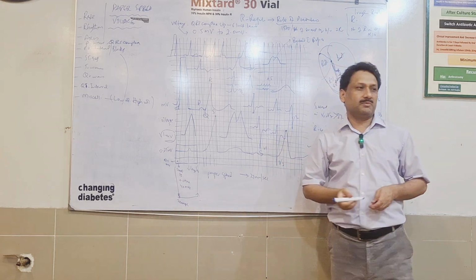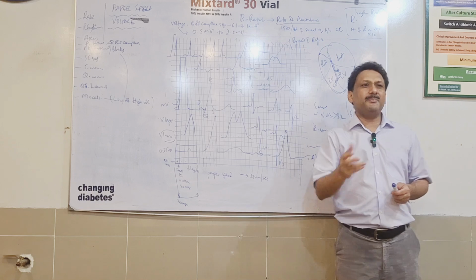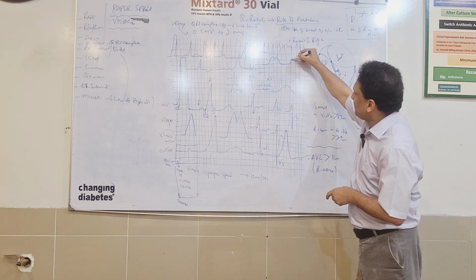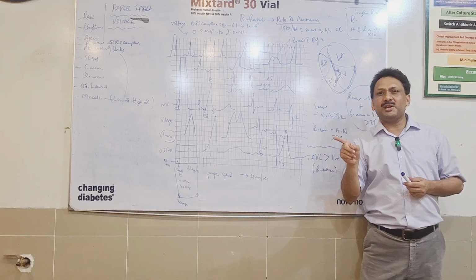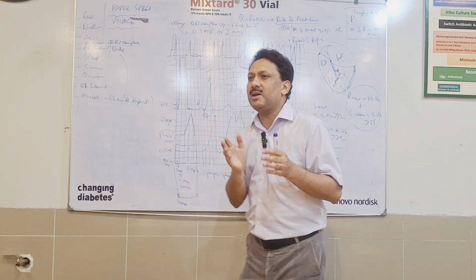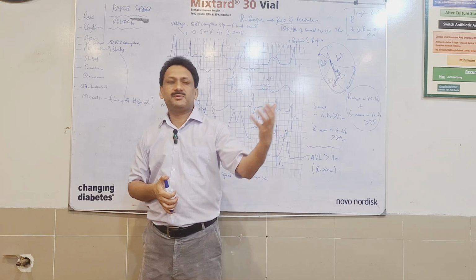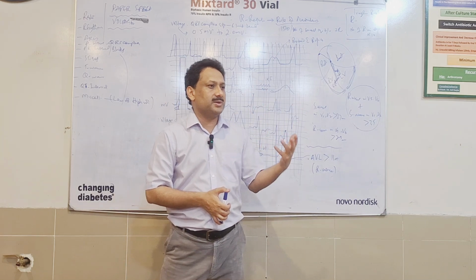The second situation is that again a person is having abnormality in the P wave, but this time this is like that. This P wave is that way. Now this would be seen in the setting of P pulmonale, like a person is having high pulmonary artery pressure due to any abnormality of the lung, say. I mean, if patient is having interstitial lung disease, a person can have pulmonary hypertension primary or secondary.